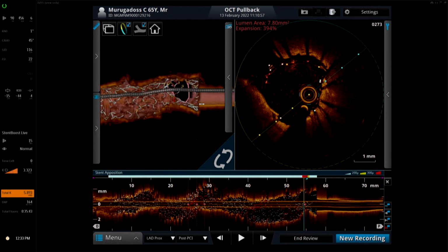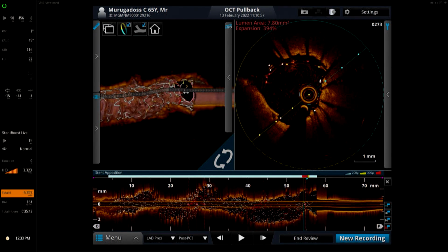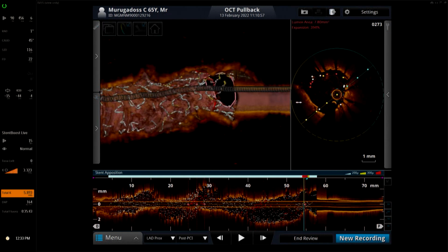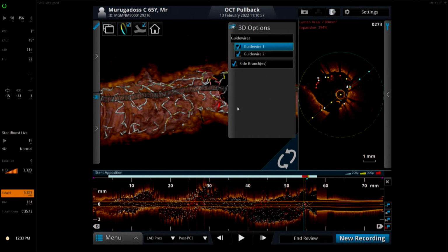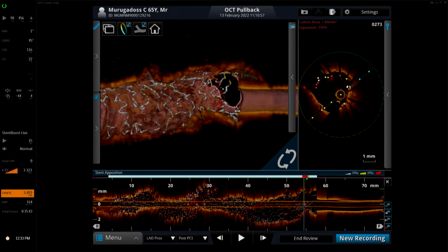3D across circle. Zoom in there. Okay, you can see those one or two stent struts at the 11 o'clock or 12 o'clock position there across the circumflex, which I didn't like. I wanted to fix that, so I re-entered angio.